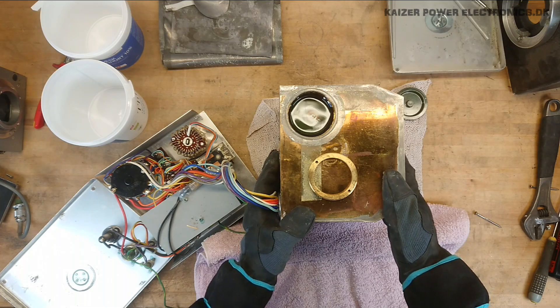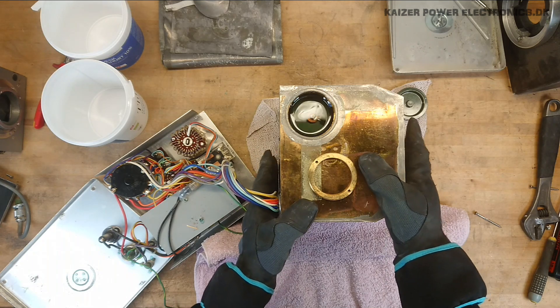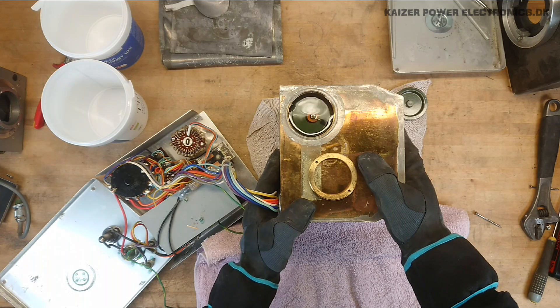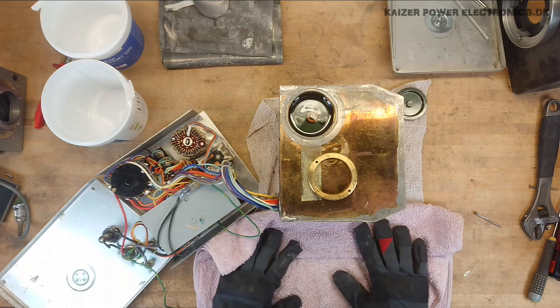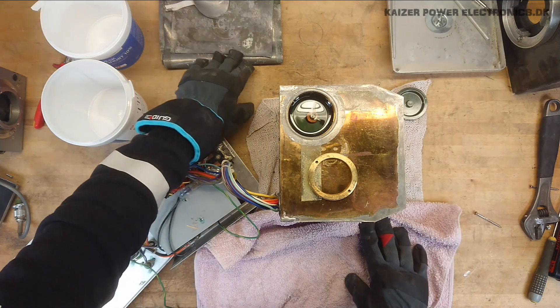That's actually interesting — the whole brass chassis here is actually the complete oil container. Just look when pressing on the side here, I can get it to raise up. Wow. It did also seem a bit leaky at the bottom when I took off the lead shielding.